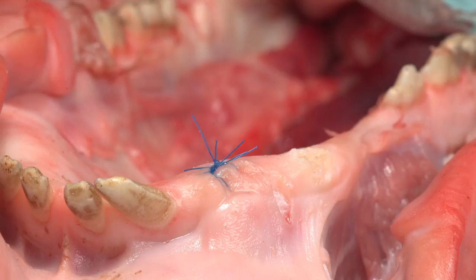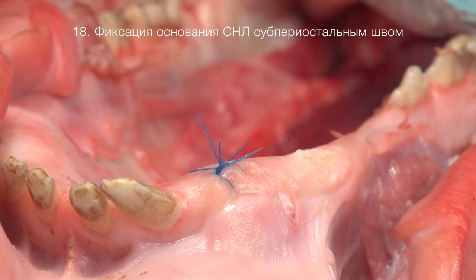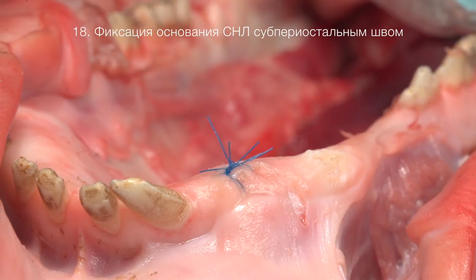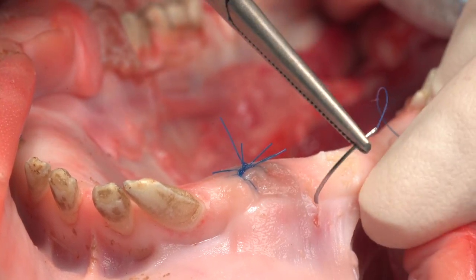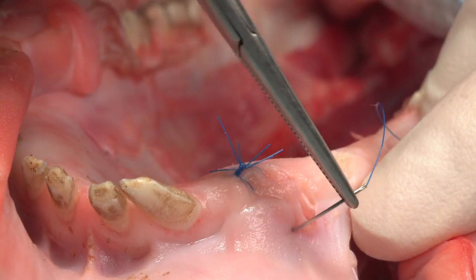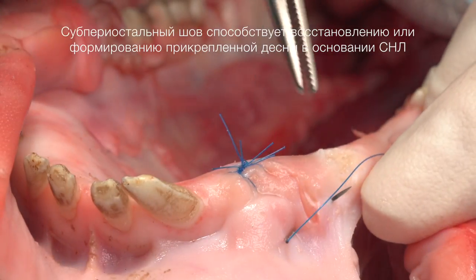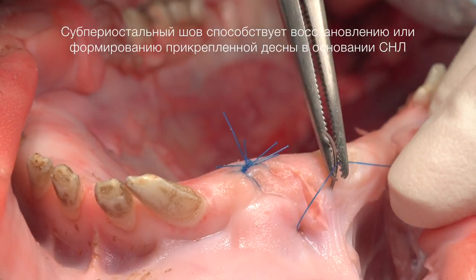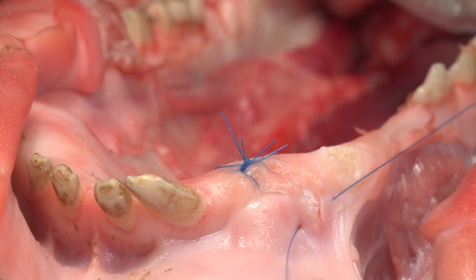Начинаю с его самой апикальной точки. Желательно этот шов выполнить субпериостальным, для того чтобы зафиксировать лоскут в новом положении. (I start with its most critical points. It is desirable to perform this suture supraperiosteally in order to fix the flap in a new position.)